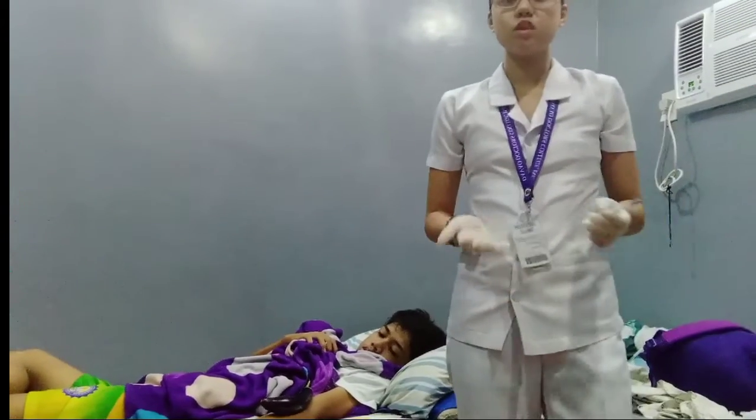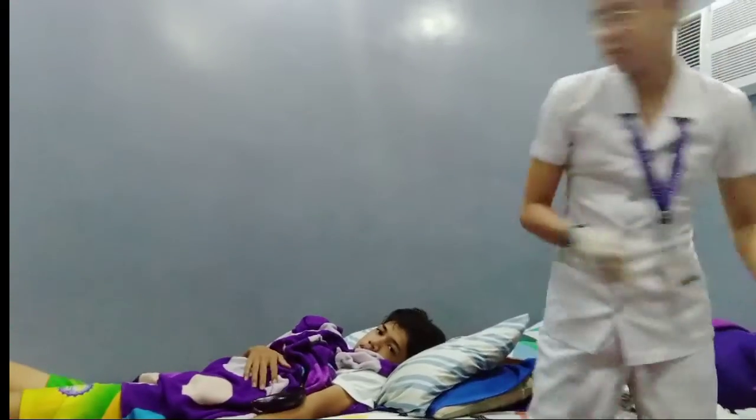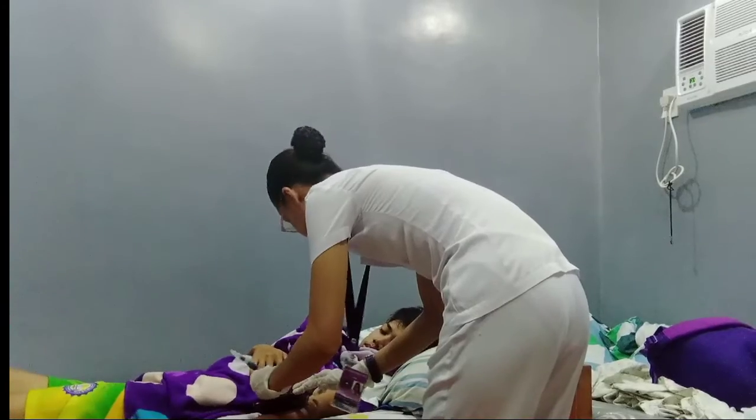Okay, encircle the wheal with a blue or black pen and instruct the patient not to rub the wheal or erase the mark. Okay, as such, I'm going to mark the injection site. Please don't rub it or scratch it, okay? Yes.